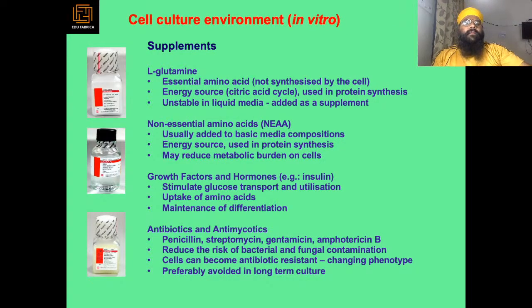The cell culture environment also includes supplements like L-glutamine, non-essential amino acids, growth factors, hormones, antibiotics and antimycotics. So these are the various functions. L-glutamine is an essential amino acid and energy source, but it is unstable in liquid media. That's why it is added as a supplement.